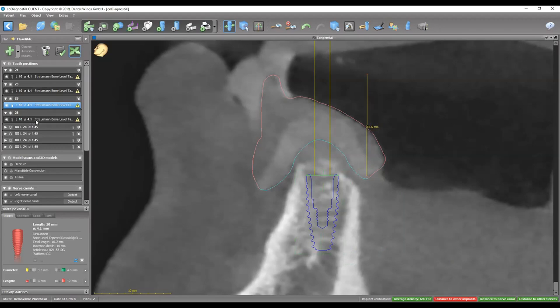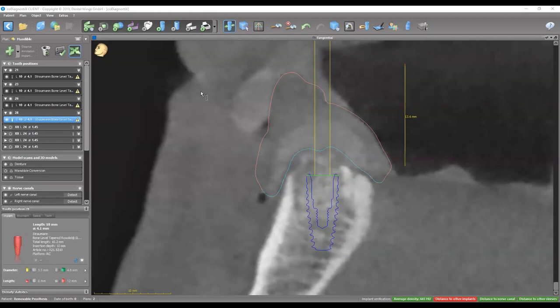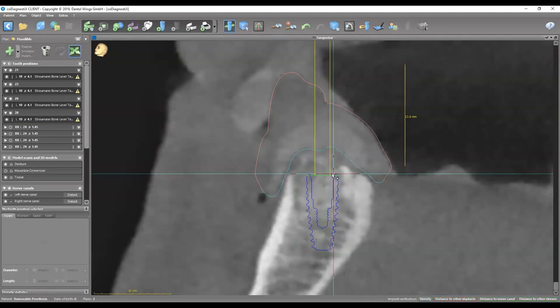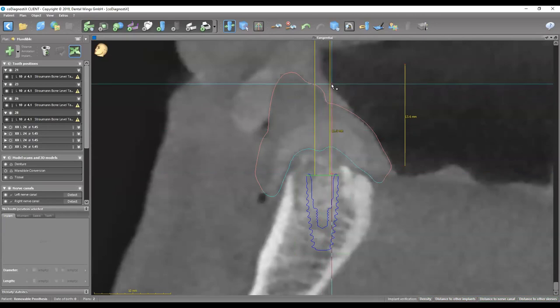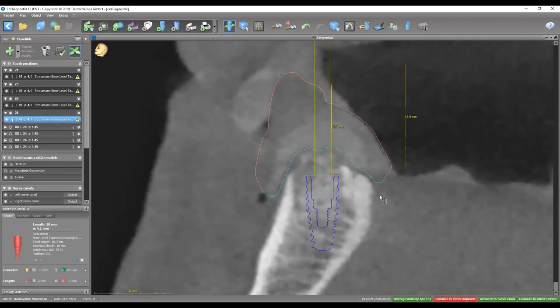Moving to the distal ones — number 28, also a 4.1 by 10. You can even place a 4.8 by 10, but since these implants are going to be used only for retention, you don't want them too big. A 3.3 or 4.1 millimeter implant would do. There was a question about whether the 10 to 15 millimeter distance is from the implant platform to the occlusal table — for number 28, the distance from the platform to the lingual cusp of the bicuspid is still around 12 millimeters, which is good.